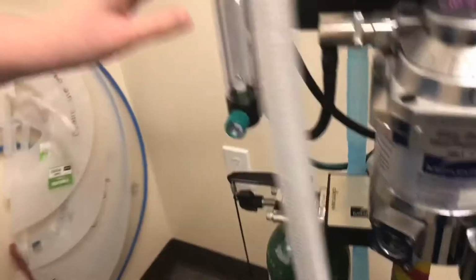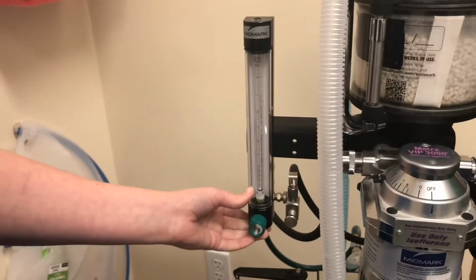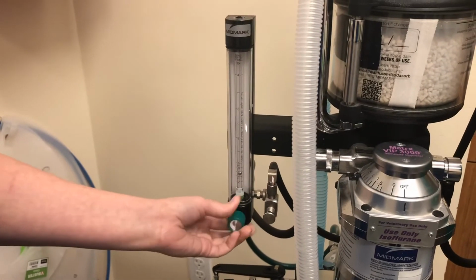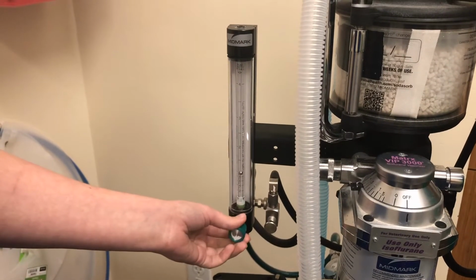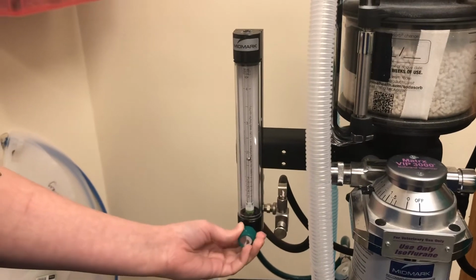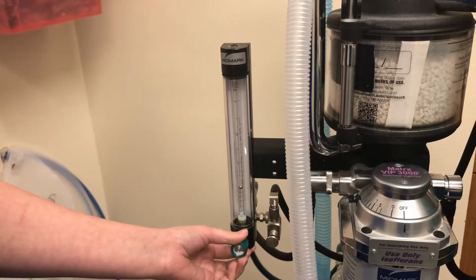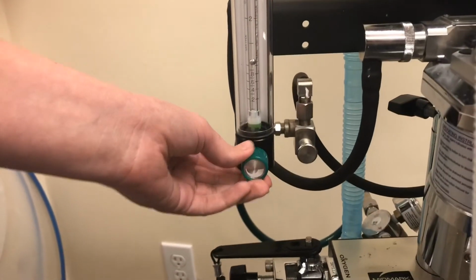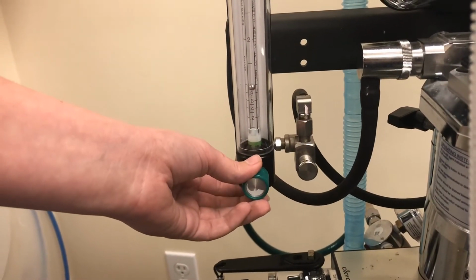The next thing to look at is our O2 meter. This looks at how much oxygen is flowing through your machine. Most procedures are run between 1 and 2. This is in liters. The ball is letting you know this is 1, not this or this, but the ball has to be right on the 1.